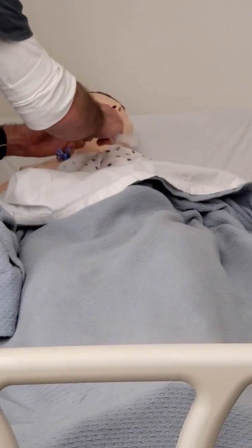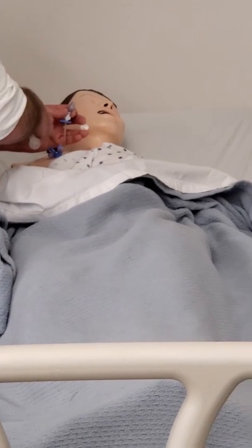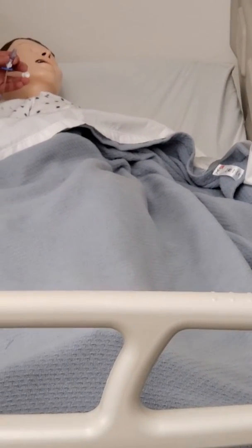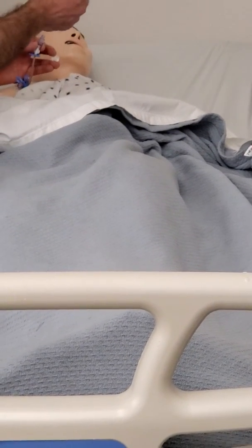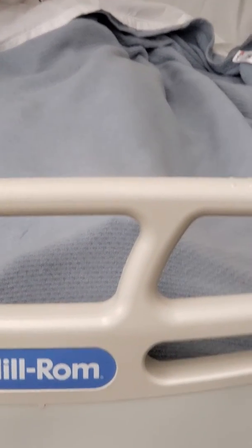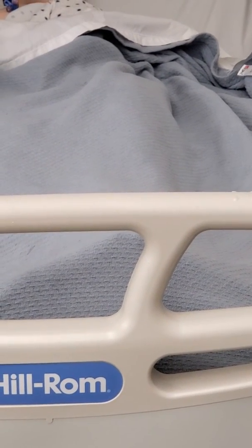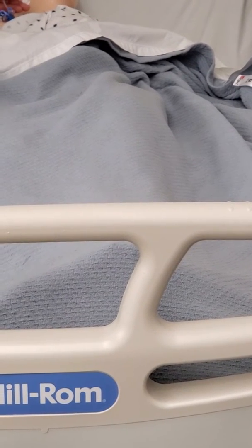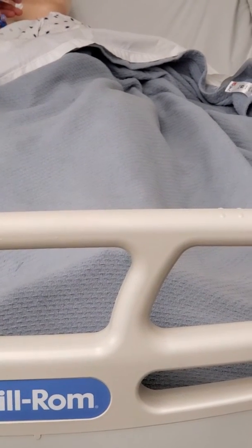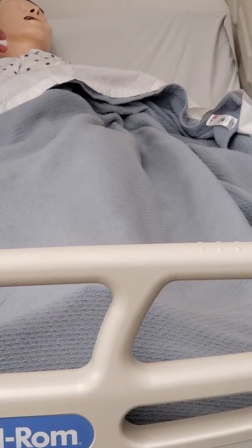I'm gonna keep it up. And these are all locked. The clamps are all locked in all of them, including the one I'm gonna be injecting the saline. Now hold up your syringe. What's in there? Saline. What else? Air. Oh, I'm gonna pull back first. Yeah, now it's coming back to me.